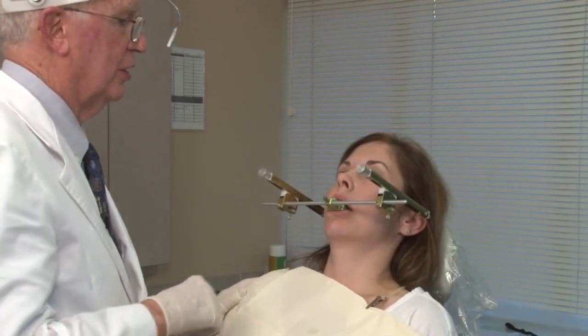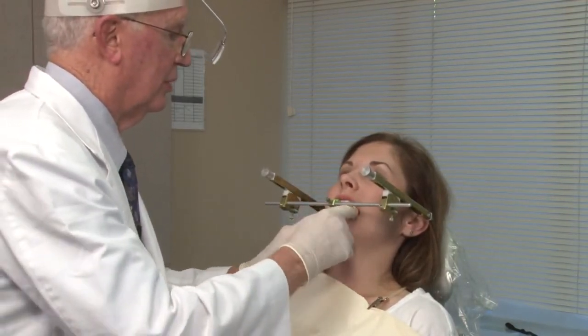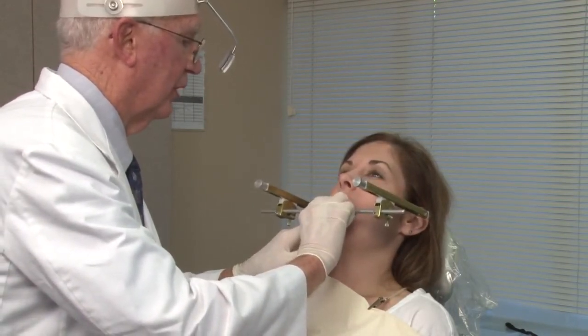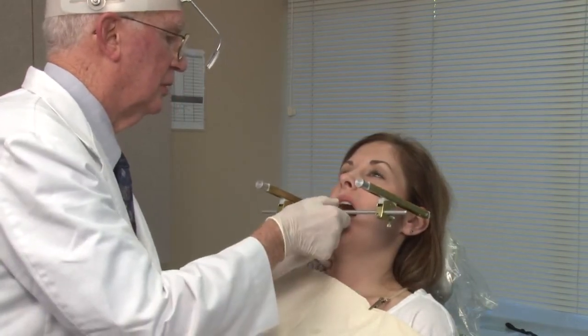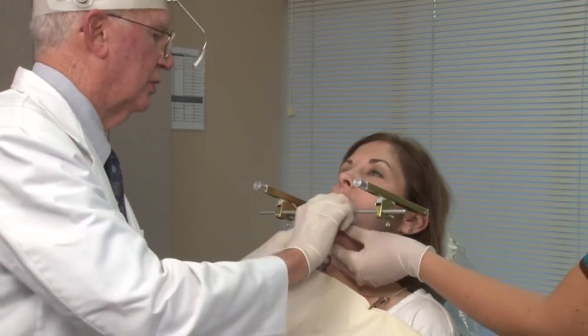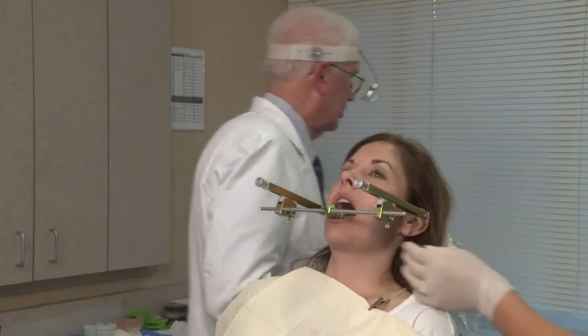Now I'm going to take the clutch assembly off, and this may feel a little bit tight, but we'll see. Let me know if this bothers you. Good clutch. I tell you what, let's get rid of the side arms.